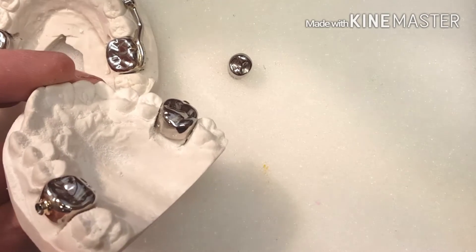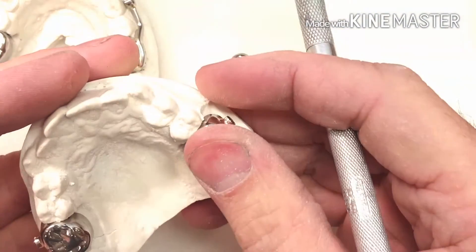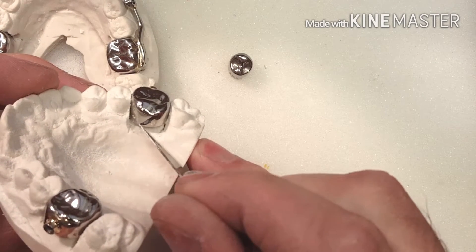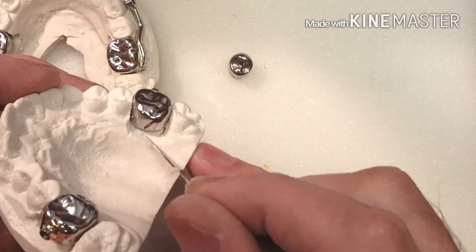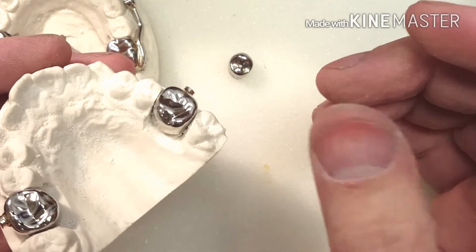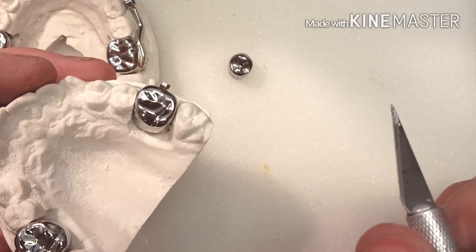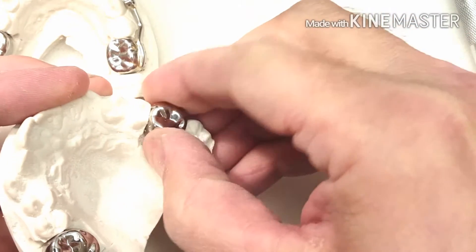Some doctors prefer to have it a little bit long so they can push down and seat it. And some doctors will want me to cut this off — they'll write it on a prescription to remove the distal portion. It actually makes the crown a little bit shorter, but it has more of a snug fit. Either way they're going to fit great. It's all preference, but I'm going to demonstrate what takes place with each crown.